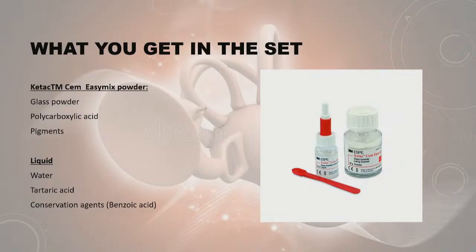You've got about 35 seconds to mix it. You've got a working time of about 2.5 minutes to 3 minutes, and it's fully set at 6 minutes. So really hard at 7 minutes.